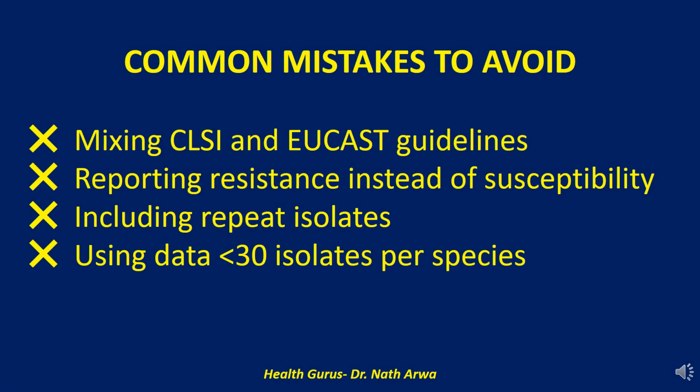You've put in the work. The antibiogram is almost ready, but even the best datasets can be derailed by a few critical, and surprisingly common, mistakes. Let's break down the top errors that can seriously skew your results, or worse, misguide treatment.